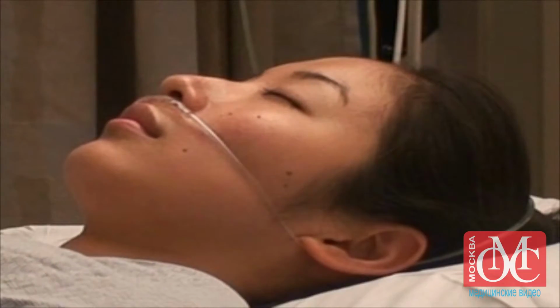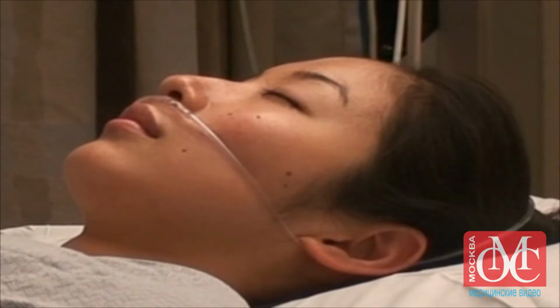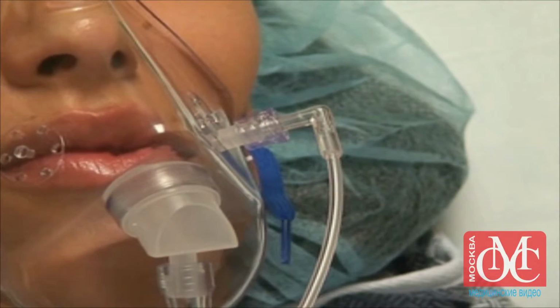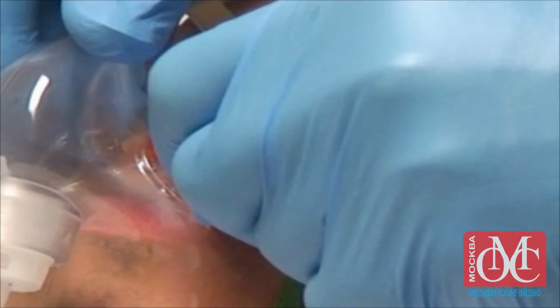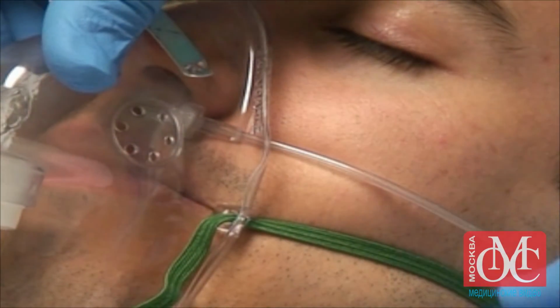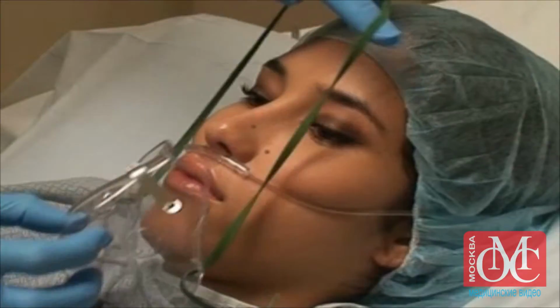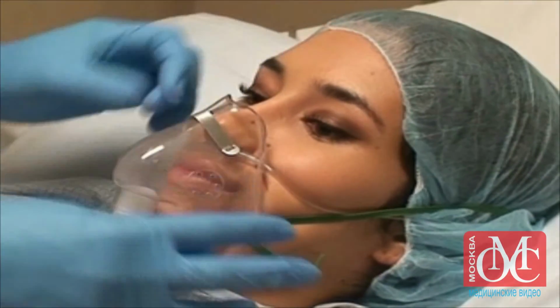However, in patients who are not intubated, sidestream capnographs can be used conveniently with a face mask or nasal cannula to monitor respiration. Nasal cannulas and face masks that feature integrated CO2 sampling are commercially available. You can modify standard face masks by attaching the sampling line directly to the orifice of a mask, or by securing the sampling line inside the mask. Take care that the orifice does not rest against the patient's skin to avoid occlusion of the flow of gas into the sampling line. Alternatively, you can place an integrated sampling nasal cannula underneath a face mask.